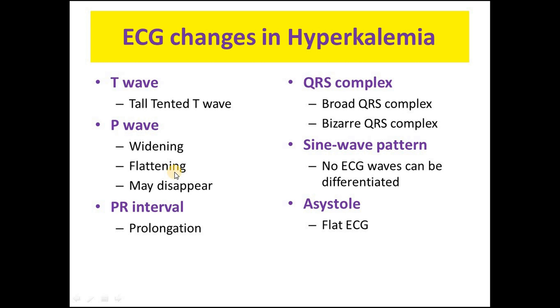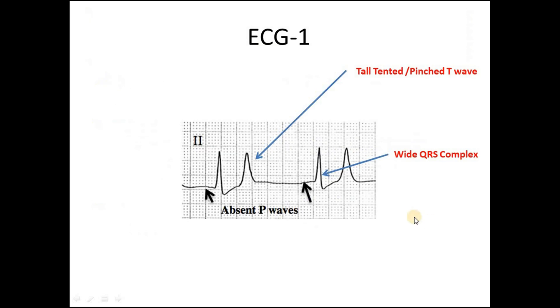Now we'll look at some ECGs showing changes related to hyperkalemia. In this first ECG, there is a tall tented T wave and absence of the P waves. You can also see a wide QRS complex. These are the typical findings in the ECG of a patient with hyperkalemia.